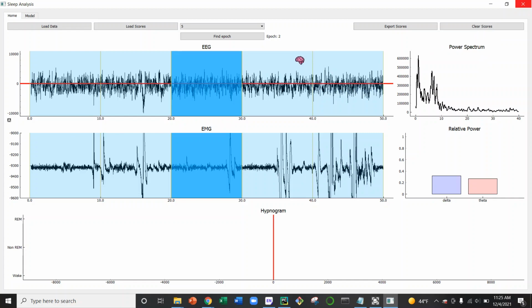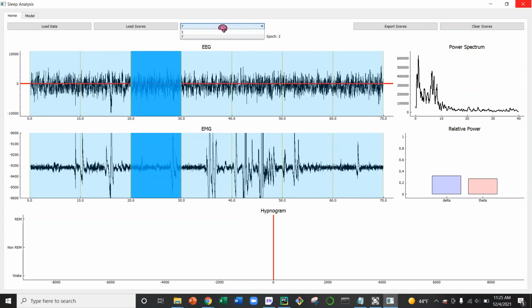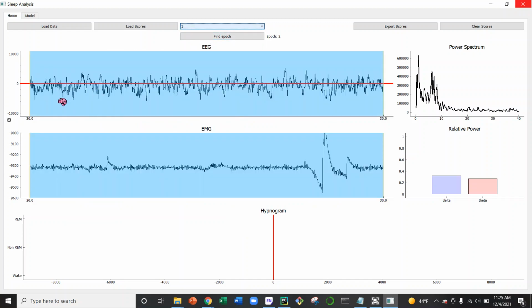The complicated way to think about this is that we're converting this EEG signal from the time domain to the frequency domain via a Fourier transform, but that's kind of obscure. A simpler, more direct way to think about it is if you zoom in. We can zoom out, we can zoom in. We can look at this 10-second snippet of the signal, and we see that it's a complicated, jittery trace. It goes up and down kind of slowly, but then there's this fast up and down action.